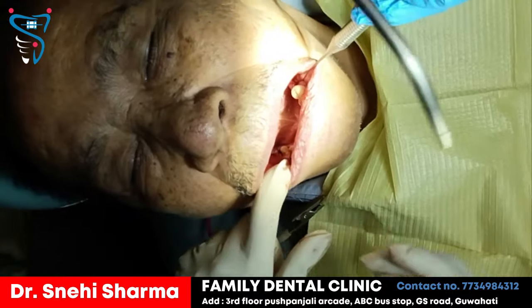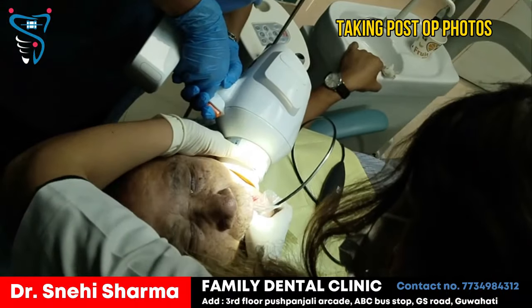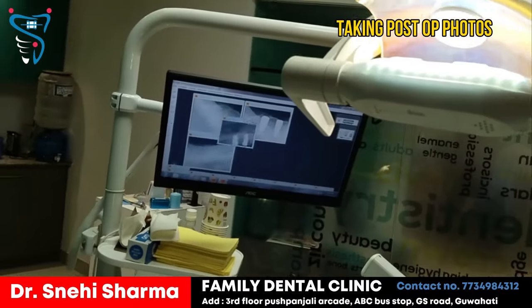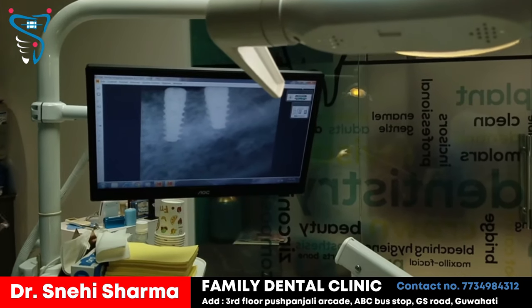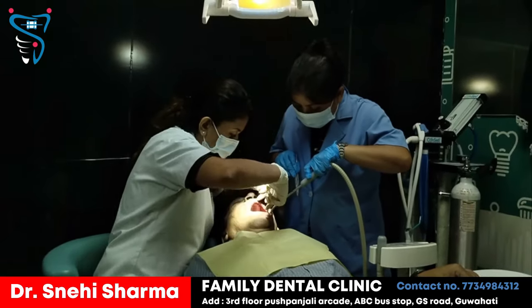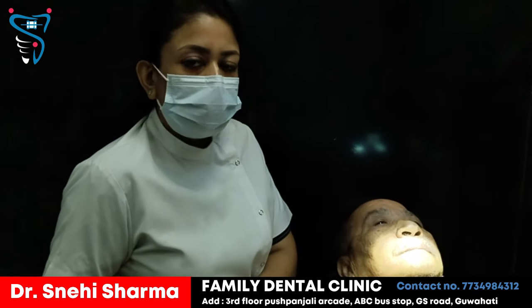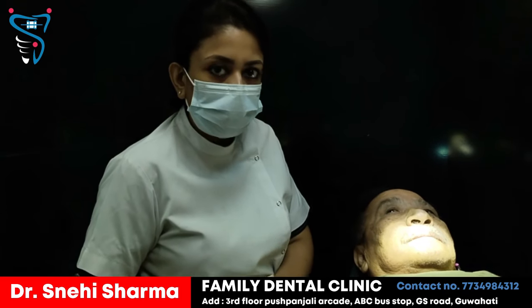I'm going to take an x-ray. Those are the two implants in place. So we are done with four implants total. We had already planned the patient's direct and indirect sinus lift, and today we have placed all four dental implants.